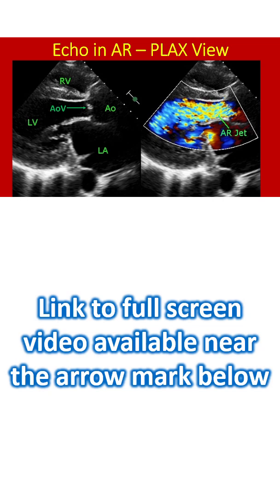The AR jet is almost filling the left ventricular outflow tract and extends well into the left ventricle beyond the anterior mitral leaflet, indicating free aortic regurgitation. Dilated left ventricle, aorta, and left atrium also suggest that the AR is severe.